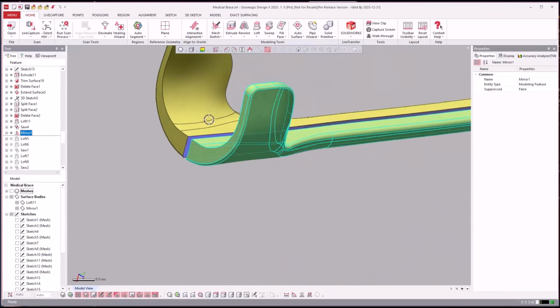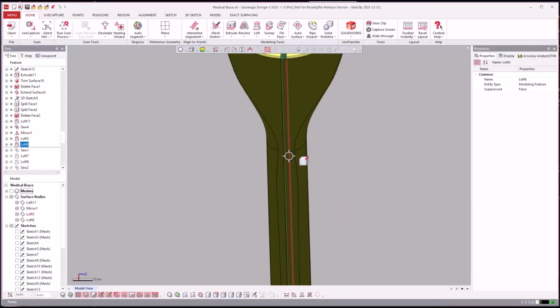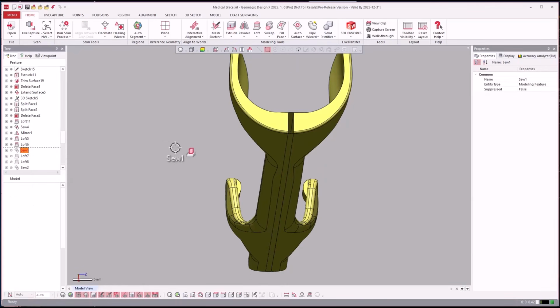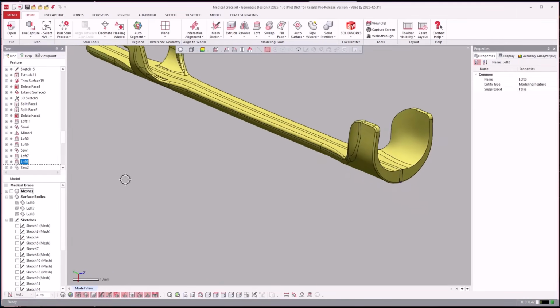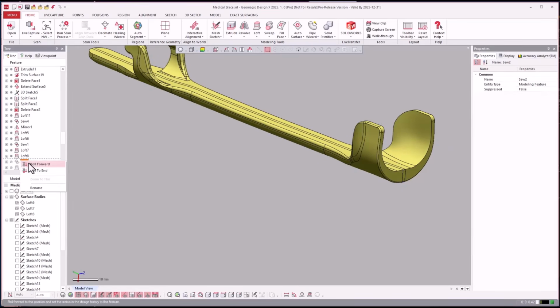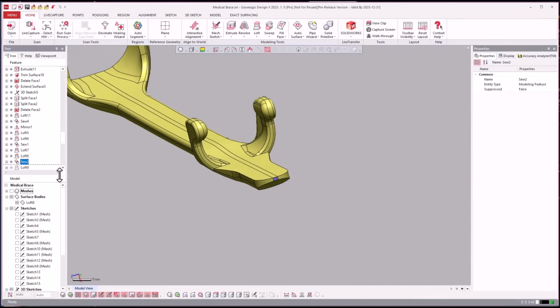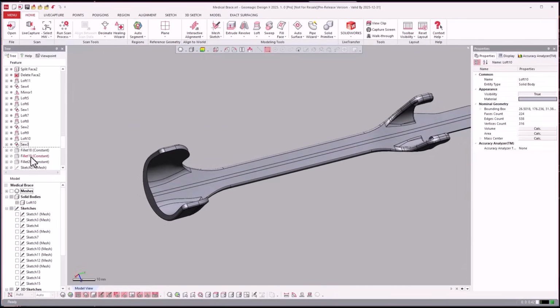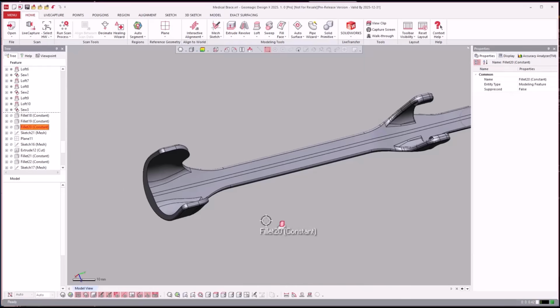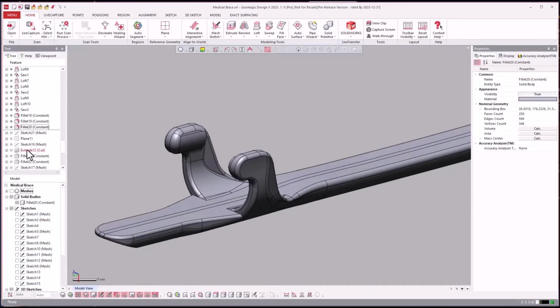Now we are going to mirror it across, loft the inner and the outer, and stitch it or sew it. Sometimes I keep using a SolidWorks term for that. And after that, we're going to loft the pieces together and sew them too. You see we still have a little piece down there. So we're going to loft, sew. Boom. And as soon as we sew it and it's a bounded shape, it becomes a solid there. Then we come in and we add some fillets, filet mignons. And then let's see where we go here.